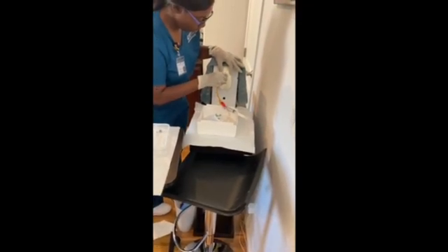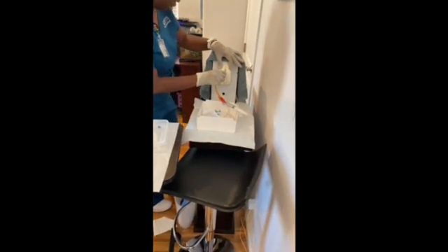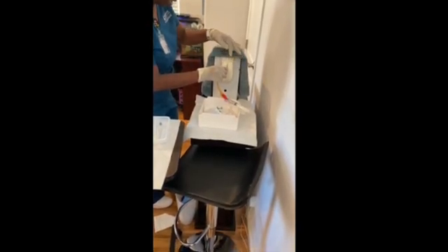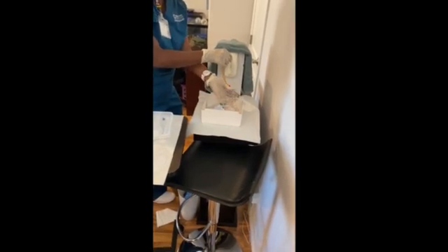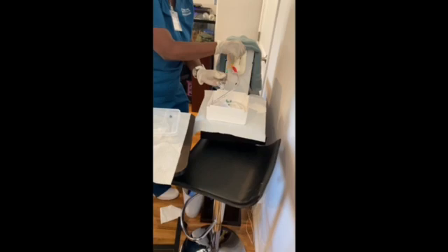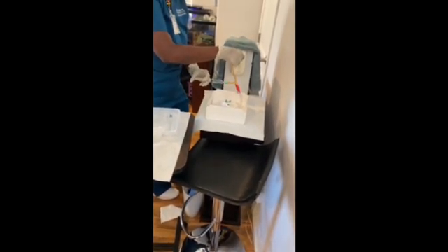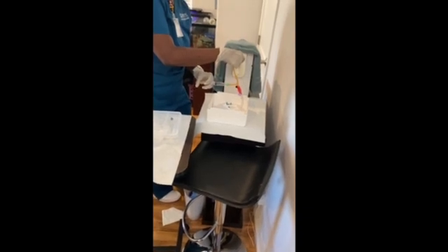If any resistance was felt, I would twist the catheter slightly or apply gentle pressure. And I am going. If the catheter touched the labia or the linens or any part of the vagina while inserting, I would consider it to be non-sterile and would have to start over again.